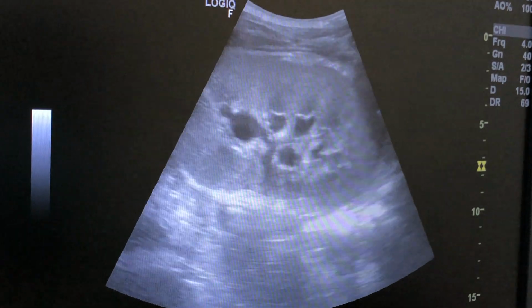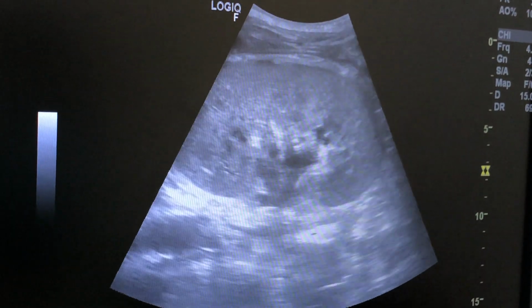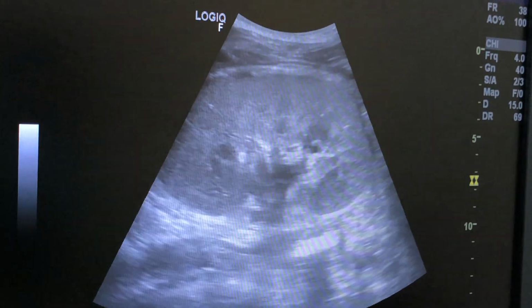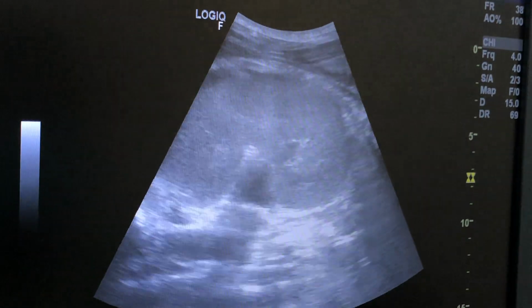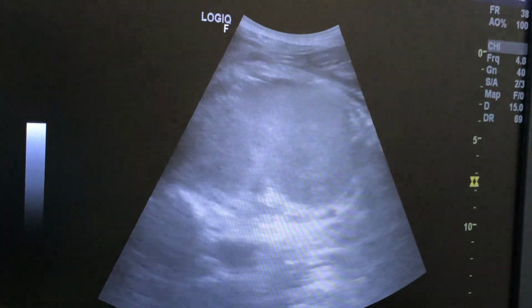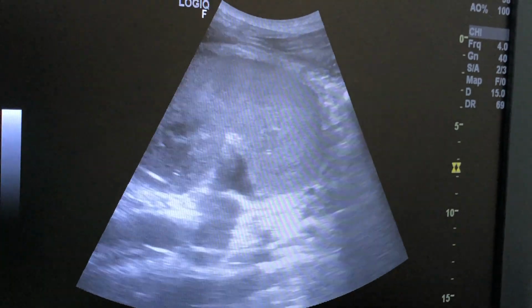The patient is having a small right kidney, approximately 50% less volume than the normal one, around 5-6 centimeter in length and 2.5 centimeter in AP view. And here the findings are that the cortex is echogenic. Second, here there is perirenal fluid. There is no calculus in the ureter.